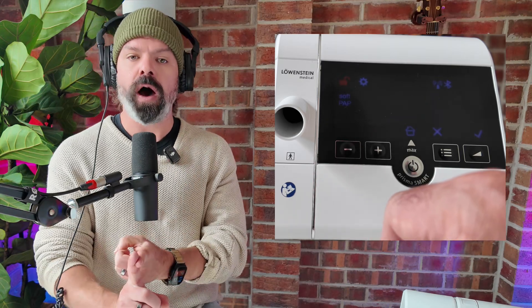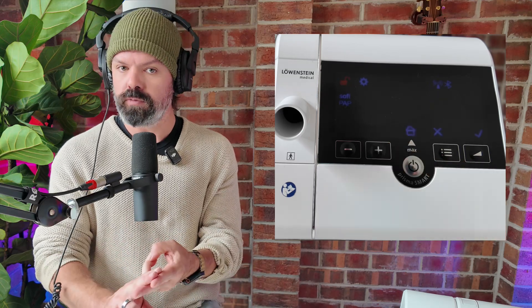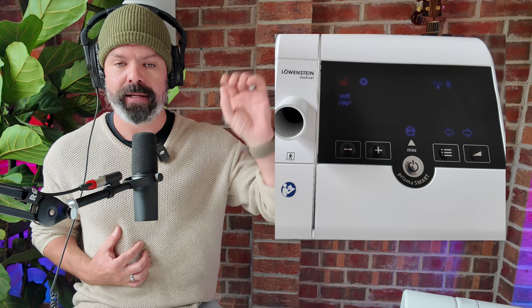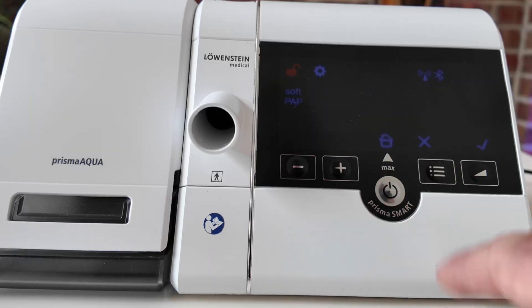Next on the menu is soft PAP. This is a comfort feature that makes it easier to exhale against the incoming pressure. There are three options: off — no reduction in pressure from the base level; level one — a slight drop in pressure as you exhale; and level two — a slightly larger drop in pressure as you exhale for even more relief. If you're new to CPAP therapy and you find it hard to exhale, start on level one and see how it feels. If it's still a bit too much, you can switch to level two — it will drop the pressure even more when you exhale, which makes it easy to acclimatize to the therapy while you're building up your lung and diaphragm muscles. And if you prefer steady pressure with no drop, you can always switch it off. Let's lock in level one.